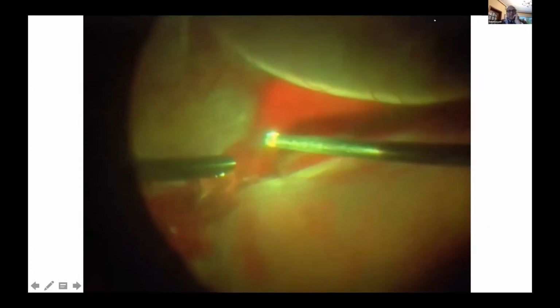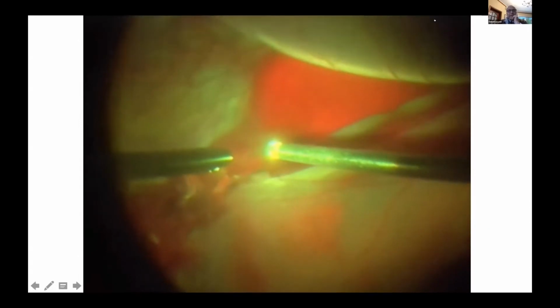I was just exploring what I could do then. And this is how the retina looks. I could not see where the posterior pole was. And suddenly I was lucky to find a retinal break posteriorly. Here I am aspirating the retinal fluid through this retinal break.